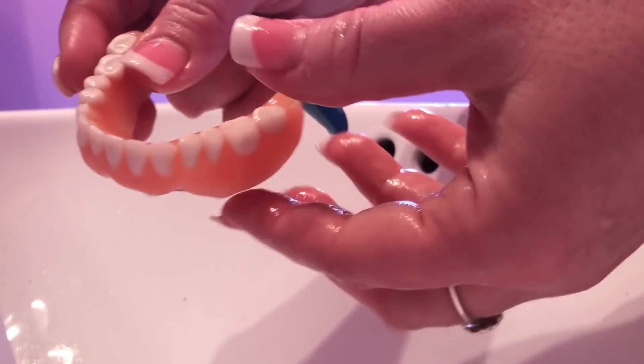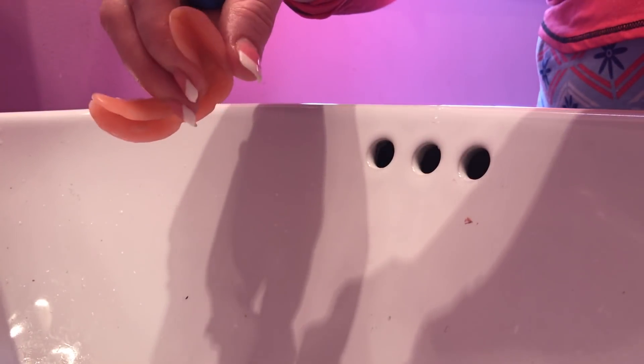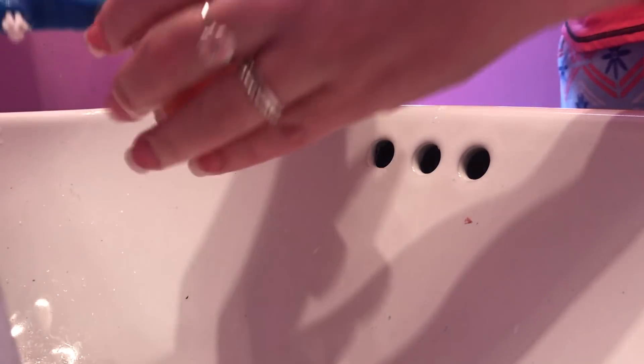Now I'm taking my bottom plate — some people didn't see it in the other video. Here's my bottom plate. I do the same thing, but you don't need a lot of paste for this one. I'm just going to clean in there.